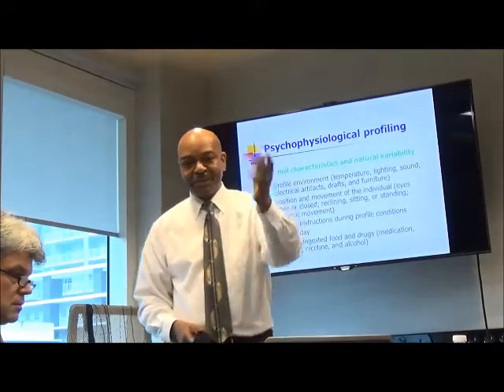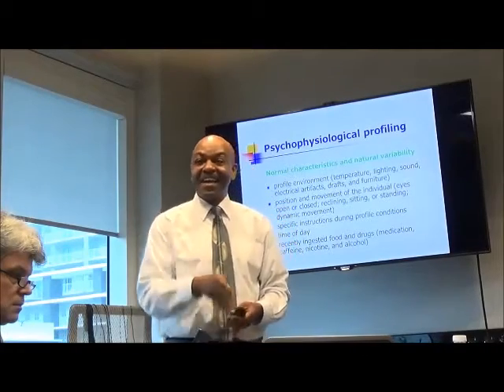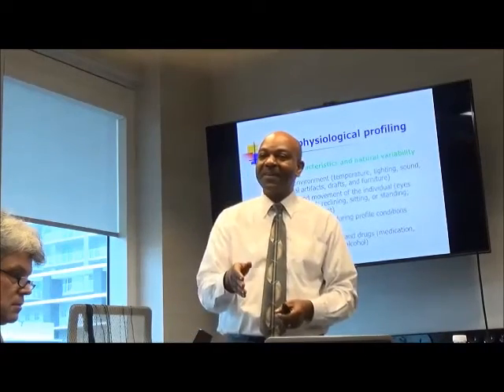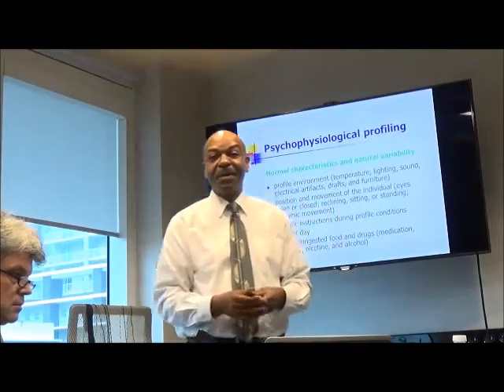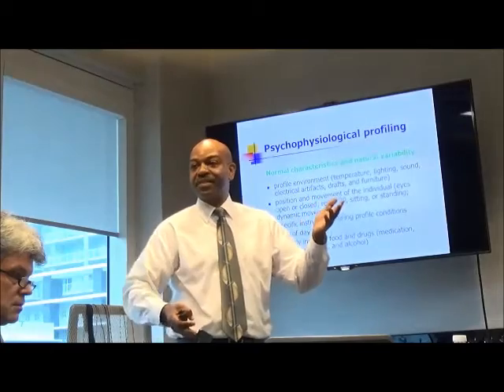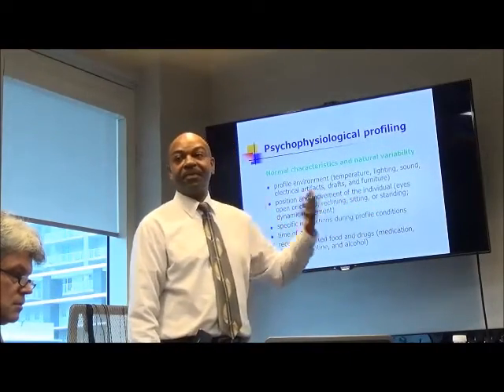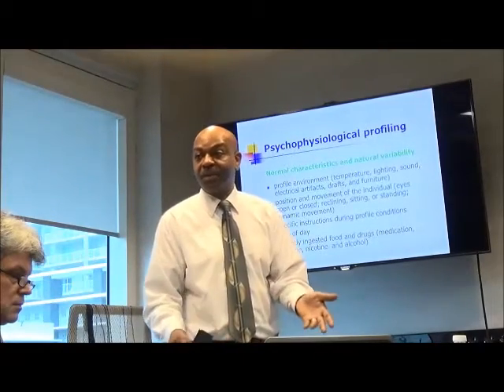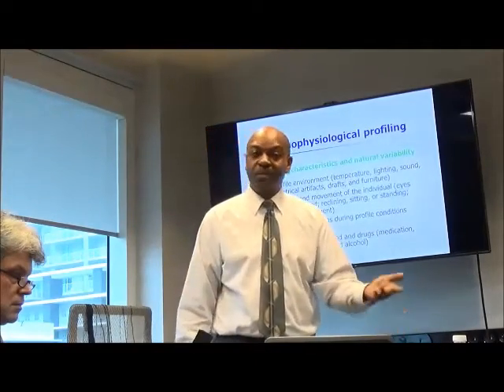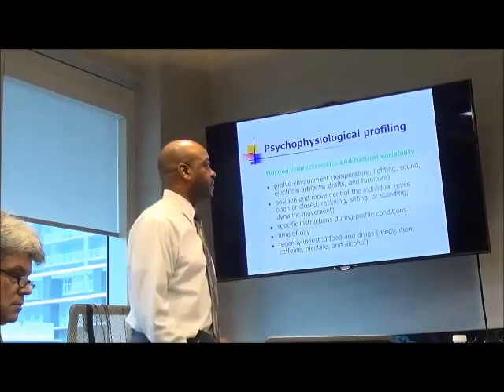So I was just experimenting with it. The graph is there. And I put an event marker at the time when she turned the air conditioning down. So just that, the temperature changed already 4 degrees within a few minutes. So if I was doing a stress assessment and the room temperature was uncomfortably cold, the person's hand temperature would probably be much lower than it normally would be, because that is a stressor.